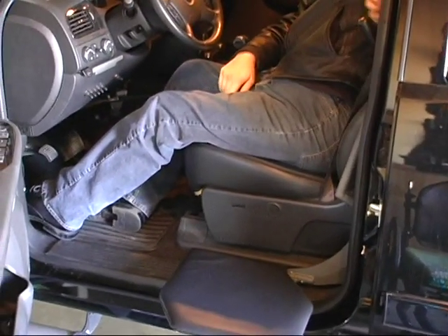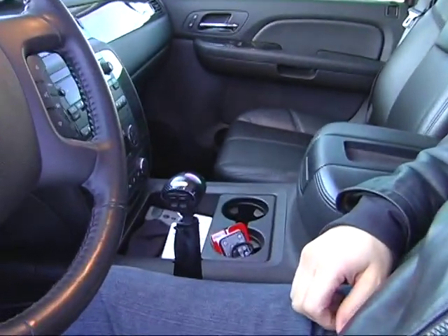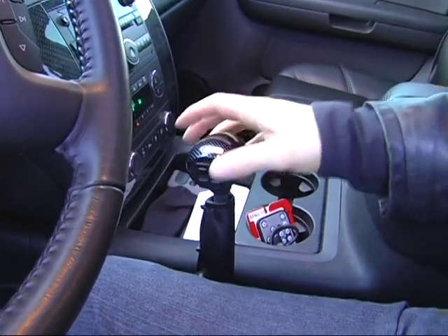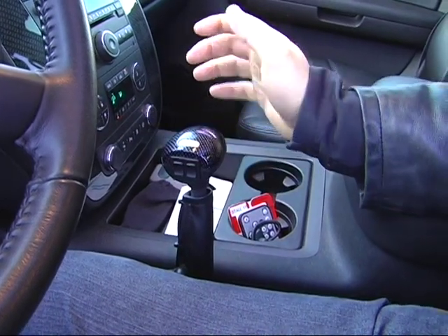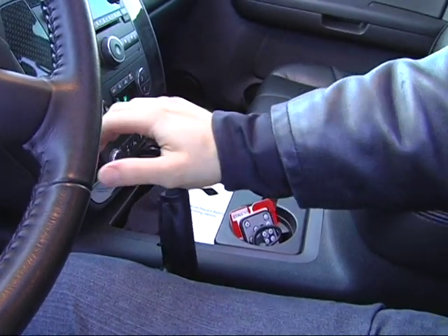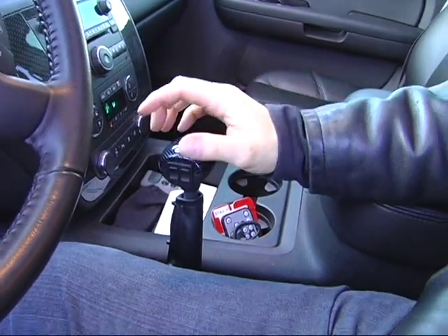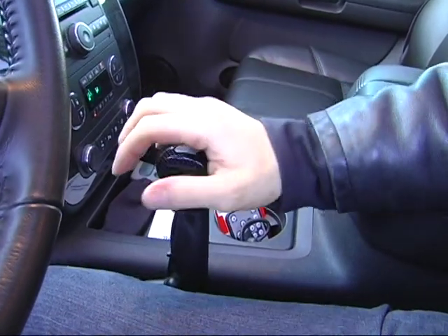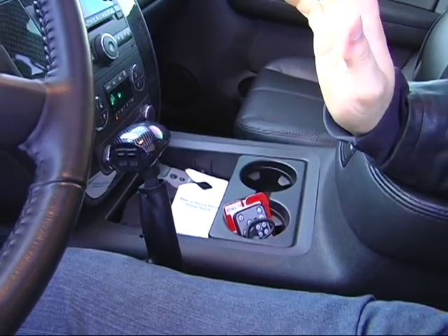This vehicle is equipped with the newest hand controls out there, and they provide a lot more ease and comfort when driving. The hand controls have the signals on them, just by a button that goes up and down. It's got the braking, which is forward, the gas to pull back, and the best thing about the hand controls is when you're sitting at a set of lights, you can lock it in brake motion, so you don't have to hold the hand control at all times.